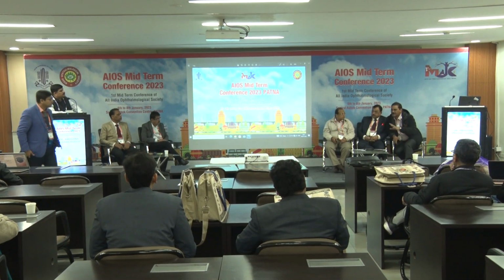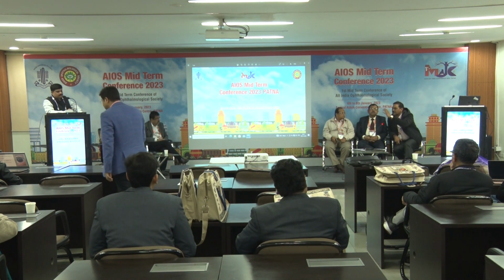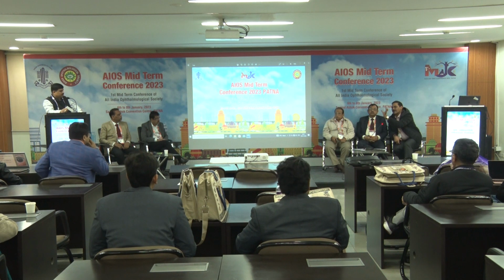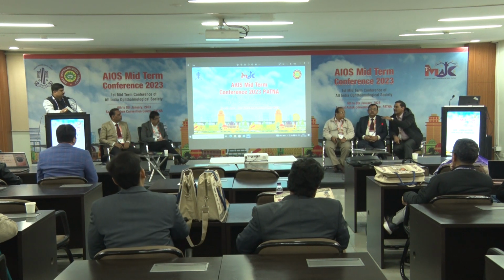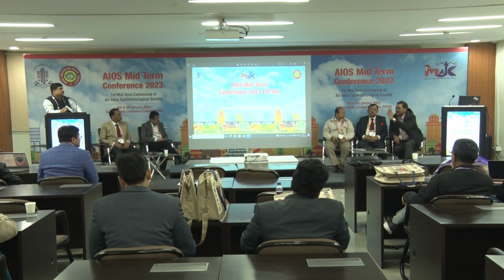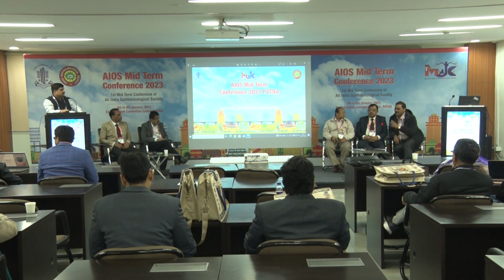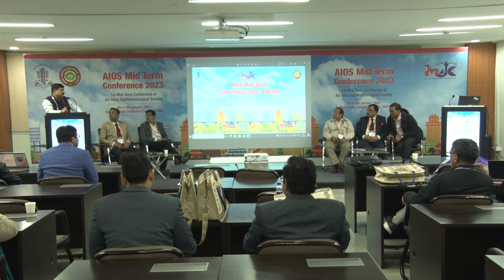So this is the problem. What happens in the IOL Master 700 with an intumescent cataract is that the effective lens position is calculated as if the lens is much anterior. But after the surgery, the lens goes back, and the patient goes hyperopic. That is the one thing, effective lens position, you have to also keep in mind.